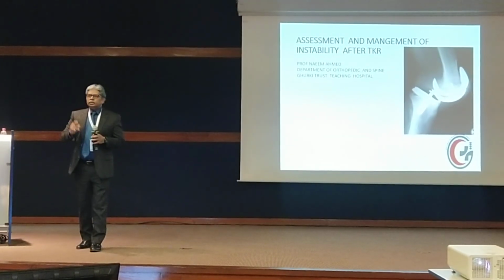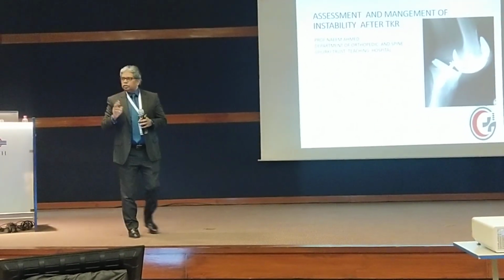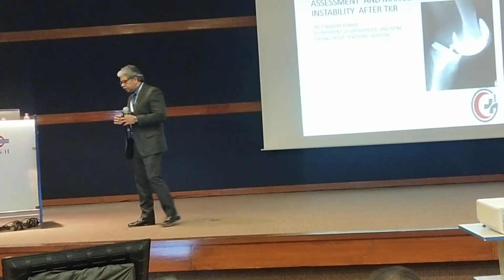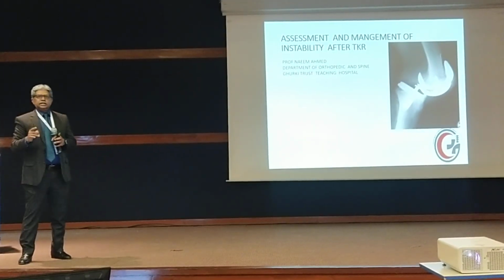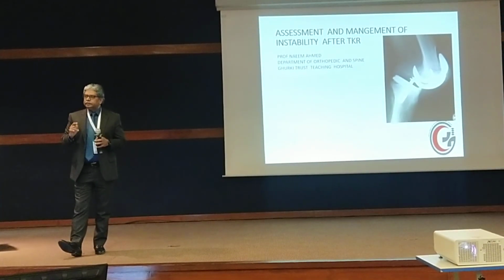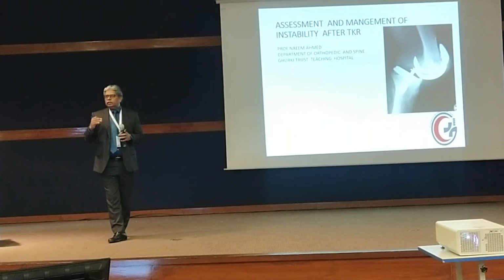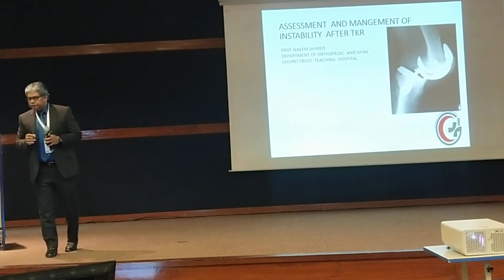Number 1, patella baja, whatever we discussed, right? Number 2, what will joint line elevation cause? Mid flexion instability. We will also explain what mid flexion instability is. So the rectification of the problem when there is more bone cut from the distal femur is by doing augmentation or distalization of the femoral component by thicker augments. So that was instability in extension.